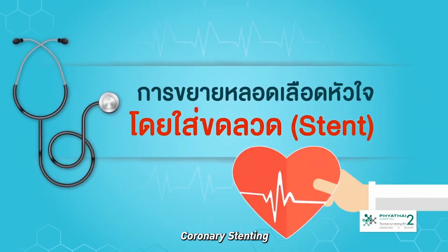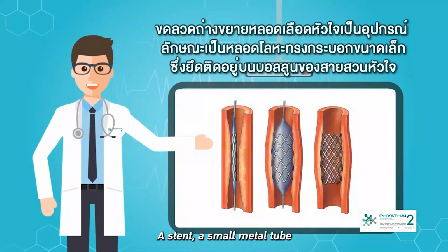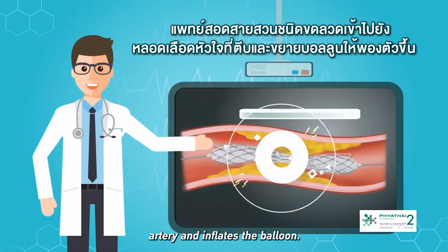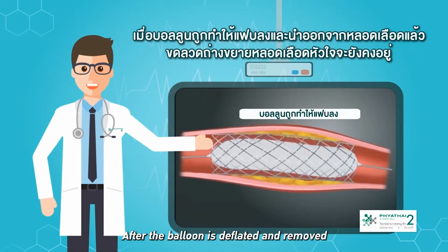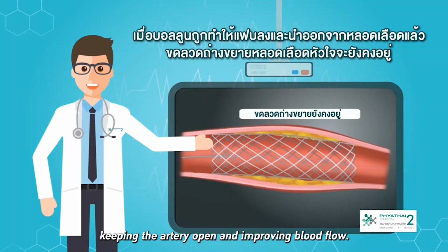Coronary stenting. A stent, a small metal tube, is placed on the balloon catheter. The doctor inserts the stent catheter into the narrow artery and inflates the balloon. As the balloon inflates, the stent expands and presses against the vessel wall. After the balloon is deflated and removed, the stent remains, keeping the artery open and improving blood flow.